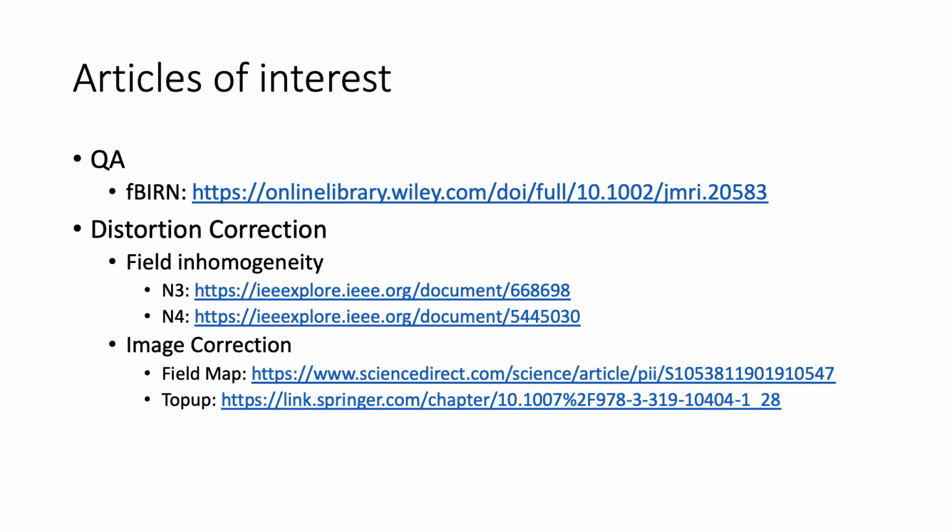I'm just wondering, for certain metrics like TSNR, I would think the expected fluctuation would be baked into a bad metric, because there's fluctuation based on the task itself, because they're doing something. It's possible it's going to influence it, but that signal's so small though, right? It's only a few percent. Whereas if somebody's moving around a lot, that'll drop your SNR significantly.